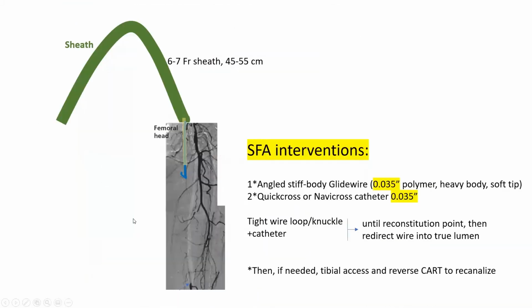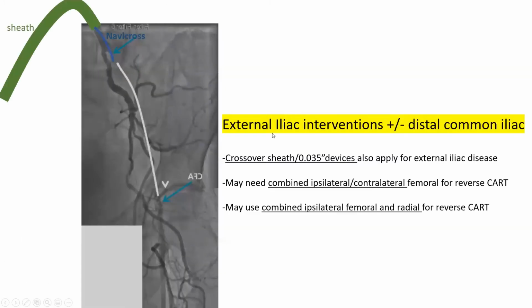So I described SFA interventions, okay? Now, in terms of iliac interventions, I will split them in two, external iliac and ostial common iliac. So for external iliac plus or minus distal common iliac, we do the same thing.